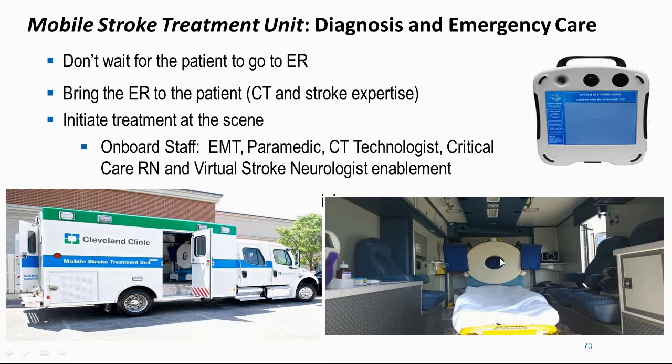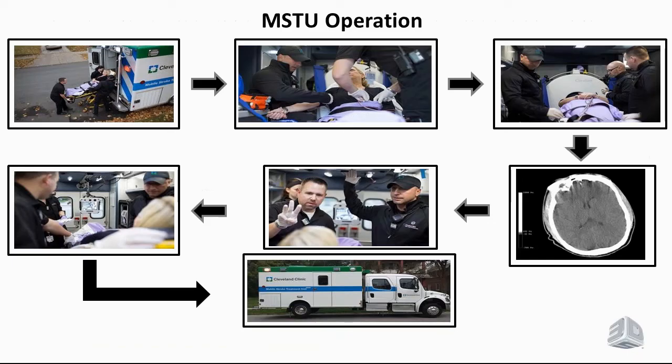We simply bought another one and put it on the truck. And then we also have this telemedicine system mounted at the other end of the truck from the ceiling that has an audio-visual connection and allows, through the cooperation of the EMTs and the nurse on the truck, the ability to do an acute NIH stroke scale. We also have small laboratory capability where we can do point-of-care testing for basic metabolic panel, serum glucose, an INR in case they're on Coumadin, and so on.